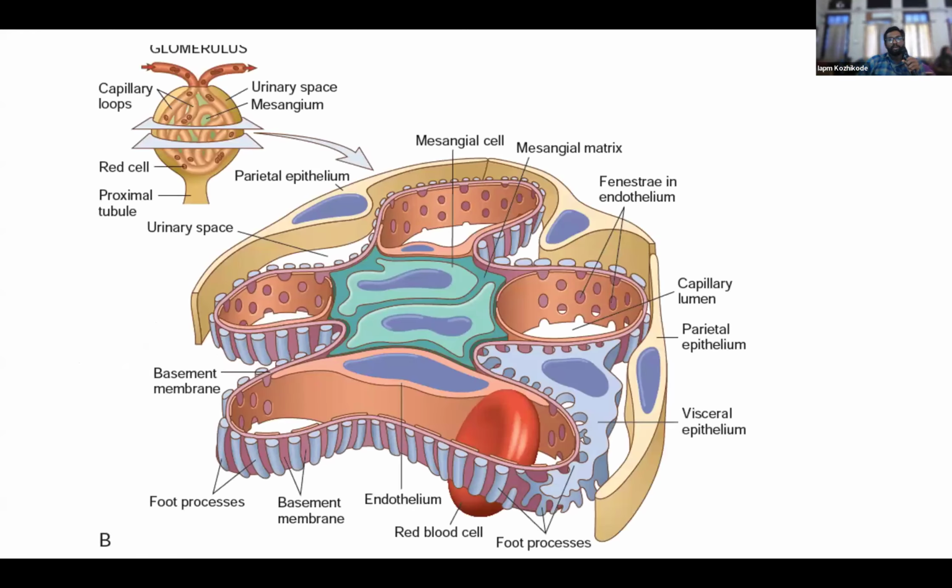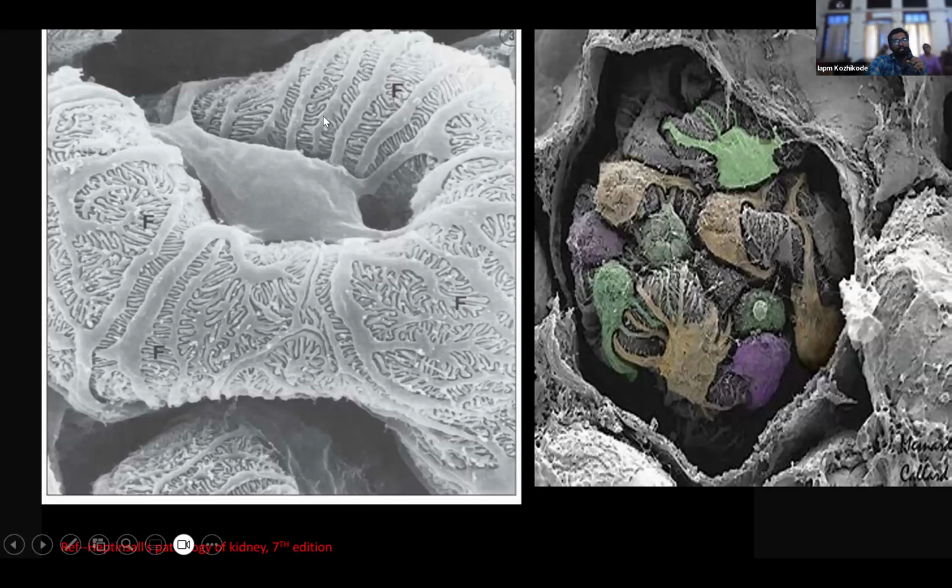Now going to an injury that is targeting the podocytes. These podocytes are just sitting like an octopus. The structure is something like an octopus. It will have the cell body, secondary divisions, and from there the tertiary smaller divisions. It is like a clasp of a hand. The adjacent foot processes would be from two different podocytes. This multicolored diagram shows that the adjacent foot processes of the zipper-like arrangement are from two different podocytes.